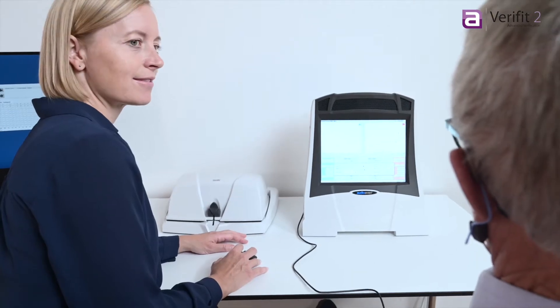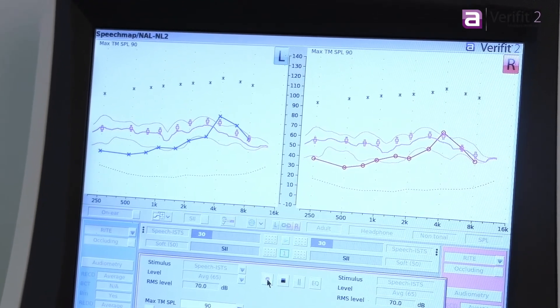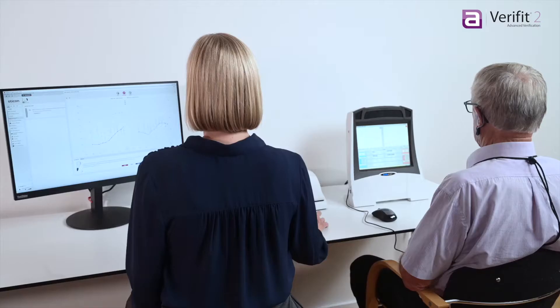SpeechMap shows you the measured hearing instrument output relative to the client's residual hearing range. Using SpeechMap, you can efficiently ensure audibility and verify to the latest NAL and DSL fitting targets.